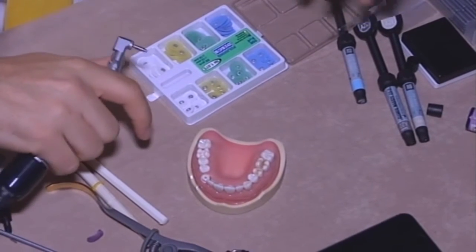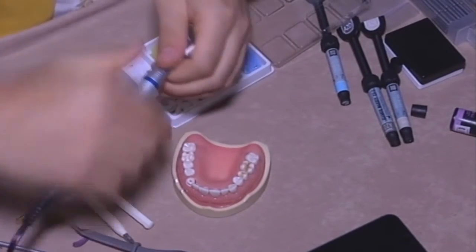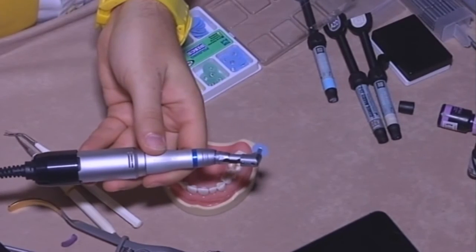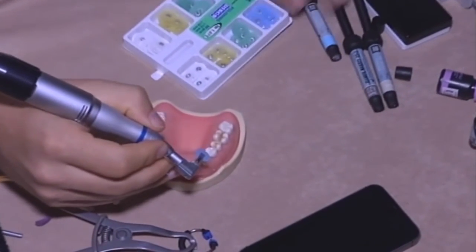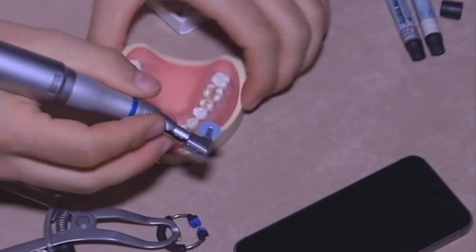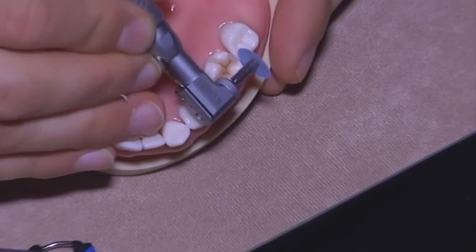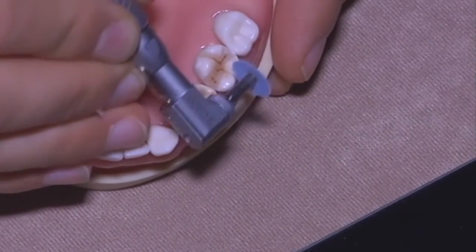I will try to save my fingers. And I prefer to work with the disc slowly, because the first step is to finish the proximal areas.